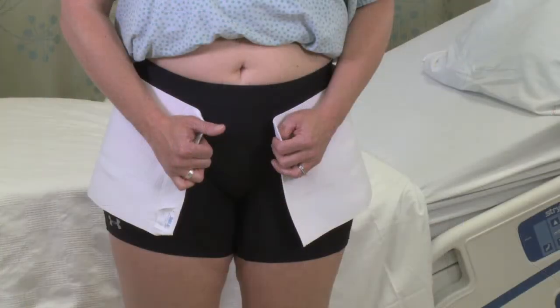Once the patient becomes ambulatory, the binder may be applied while he or she is standing. To do this, the patient or the nurse should position the top edge of the binder just below the navel with the soft lining against the skin.